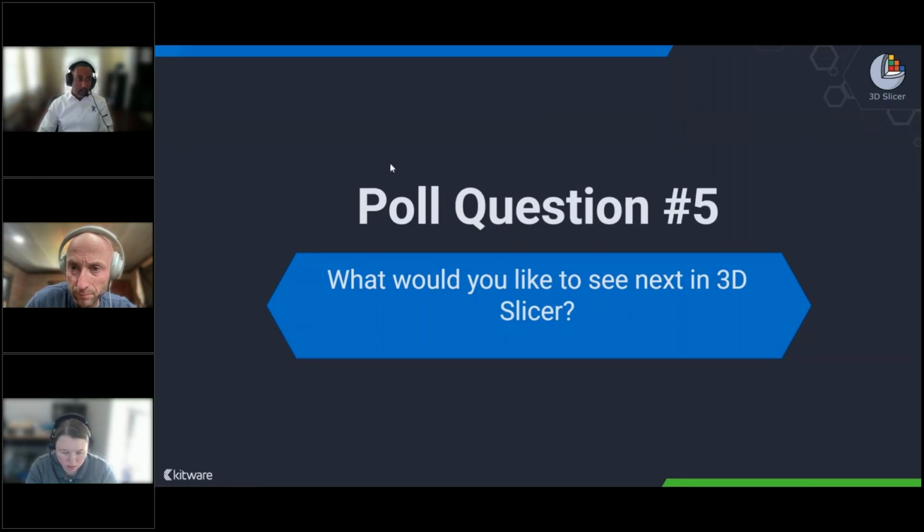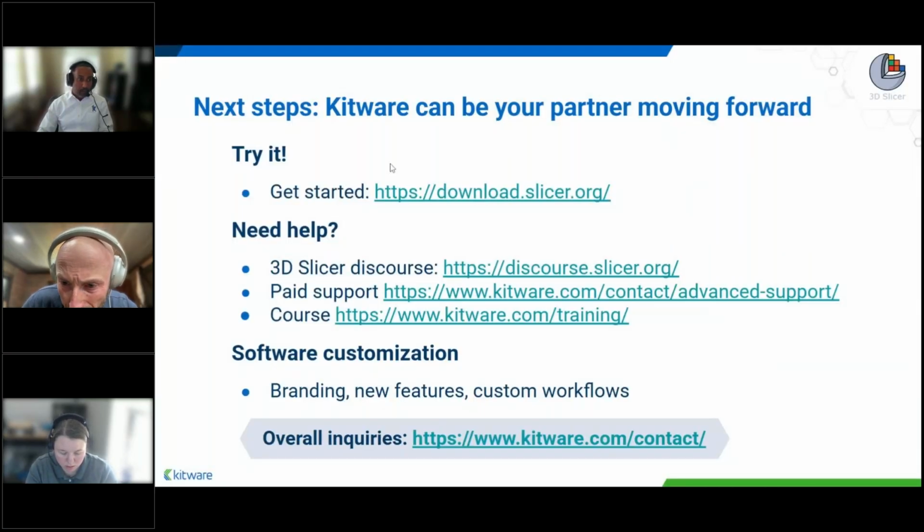All right. Well, we want to provide some resources here at the end. If you're excited about 3D Slicer, what you've seen today, and you want to explore further, here are some next steps. First, if you haven't tried it yet, again, go ahead and try it out. You can download 3D Slicer at download.slicer.org and start experimenting with it right away.